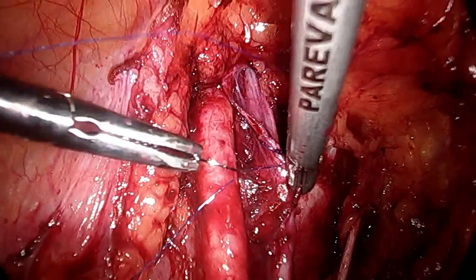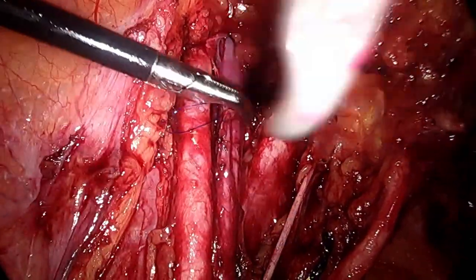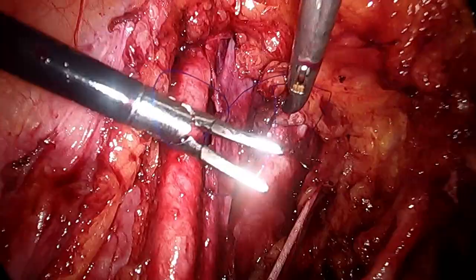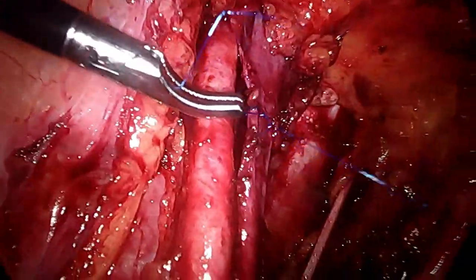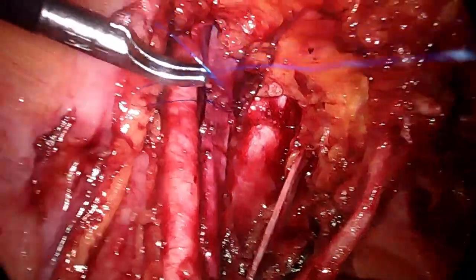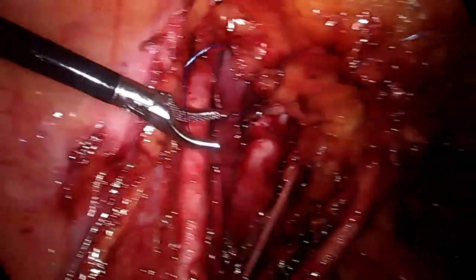Postoperatively there is no restriction of movement or diet or anything else. We just observed the patient for 24 hours. The patient was absolutely fine and was discharged on day 3 of surgery. You can notice that just with 2 sutures the vein was completely sealed.